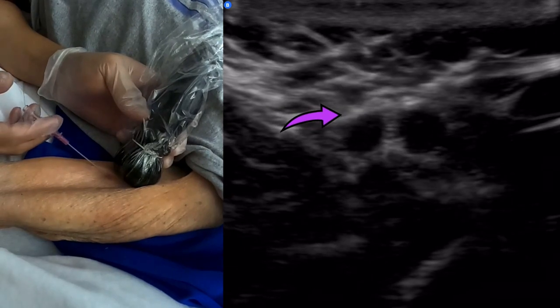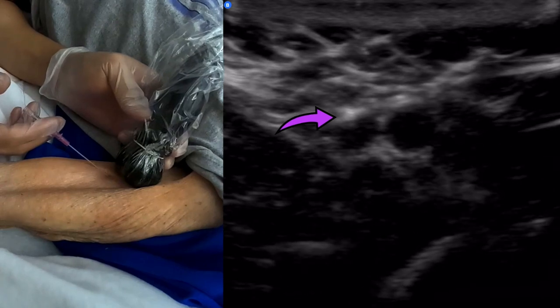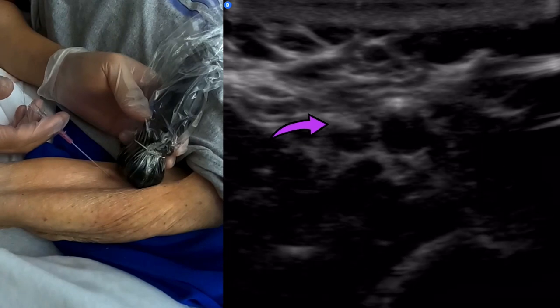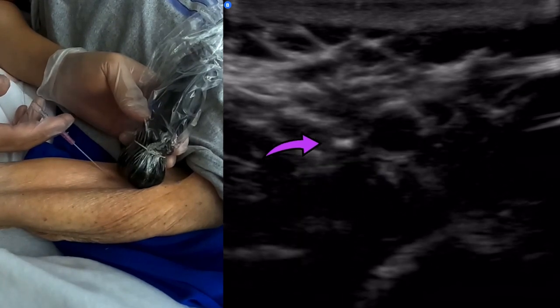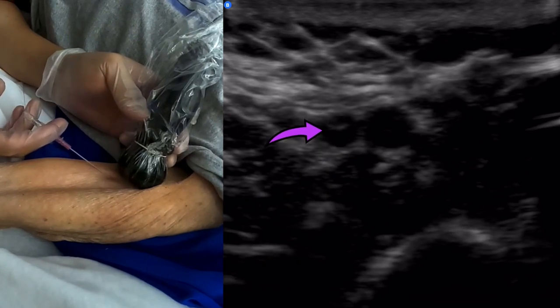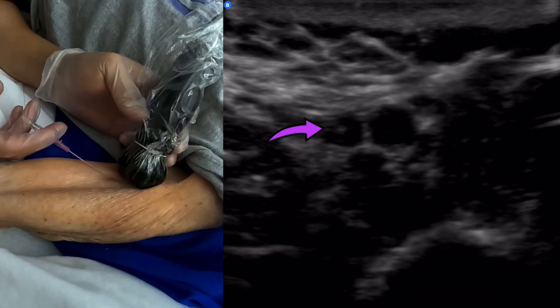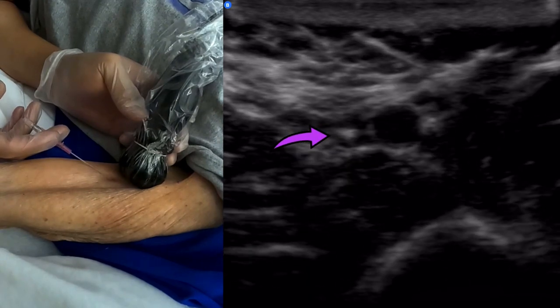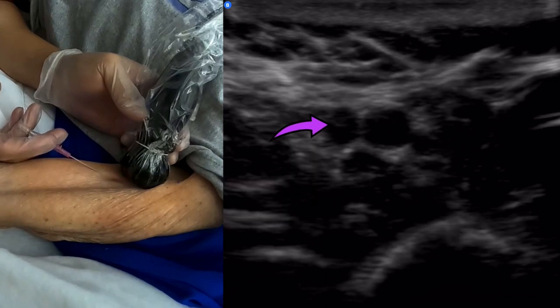Right there, okay? So now I'm right about there. Look how much more angled my probe is. Okay, so now we're gonna enter here. Right there. I'm gonna zero out, so basically center up the needle, and then I'm gonna advance so that it stays center, like that. Again, advance the probe, advance the needle, advance the probe, advance the needle, advance the probe.